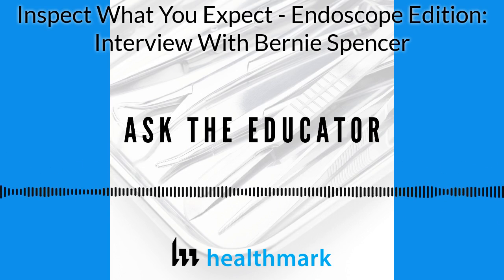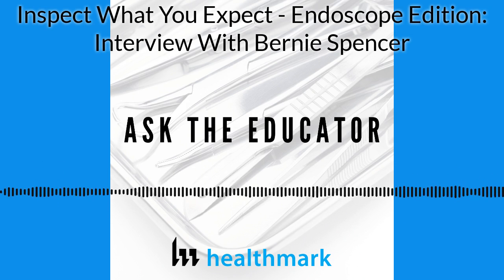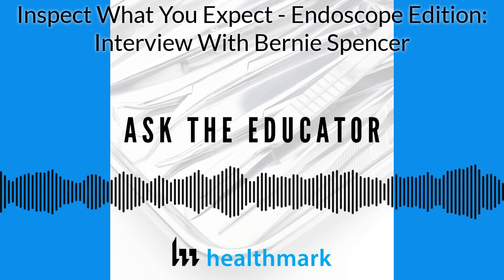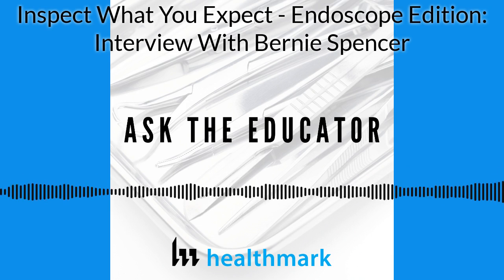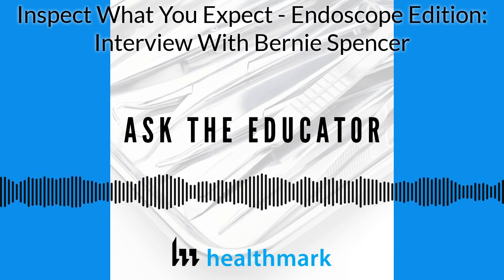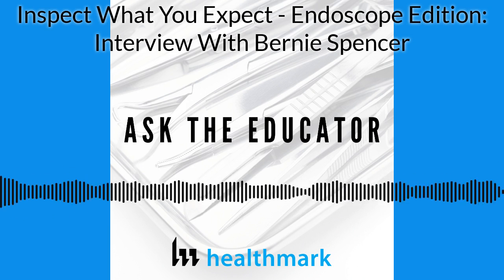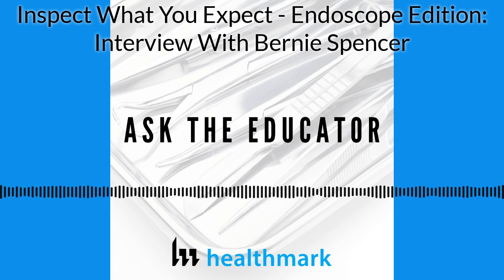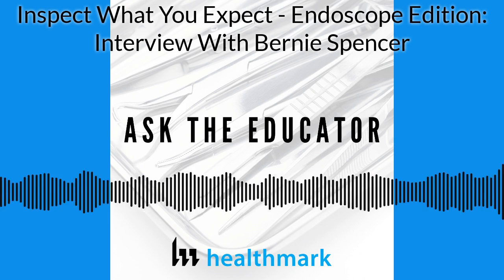This falls right in line with the first principle that I mentioned: inspect what you expect. You're expecting the brush to clean the channel, but you don't just make 2 passes with the brush and call it a day. You inspect the brush to determine if the channel has been thoroughly cleaned. Now, 4 or 5 years ago, I read some literature suggesting that even though the brush appears to be clean upon visual inspection, the channel may not be clean to an acceptable degree. If you think about it, the inspection is an indirect inspection. Given the manufacturer's instructions, you're not visually inspecting the channel directly. You're inspecting the brush to determine if the channel has been adequately cleaned.